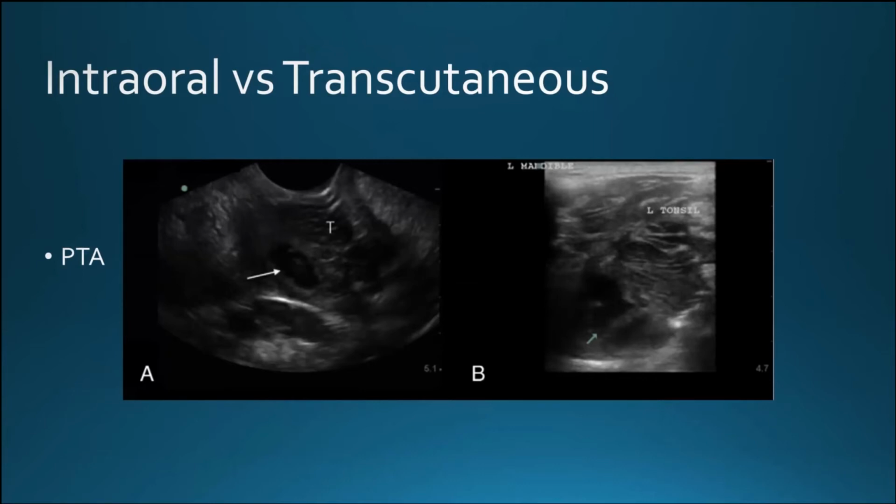Also, be aware that these abscesses can often distort or displace the tonsil either medially or caudally. Regardless of what the echo texture really is, even if you're seeing these little striated lines and thinking maybe it's a cellulitis, if you see any type of mass effect, it's usually going to represent an abscess in that location.